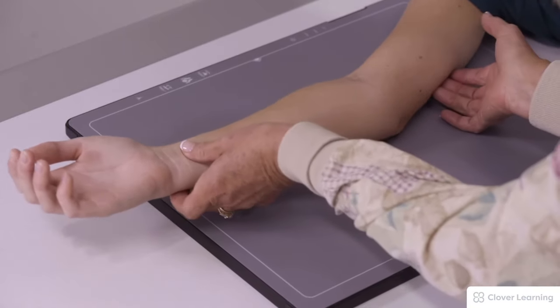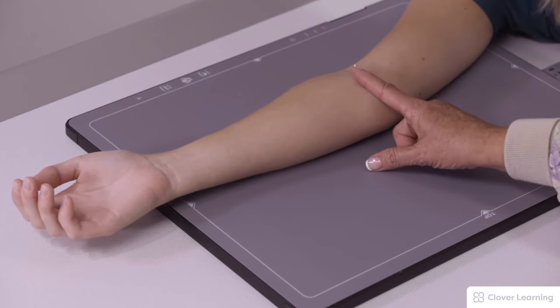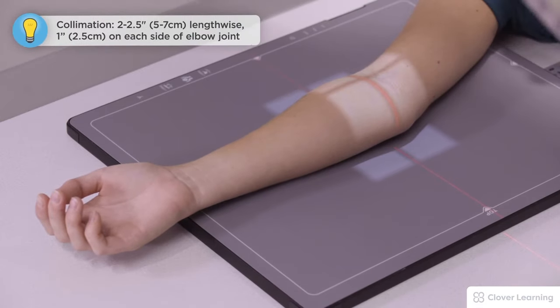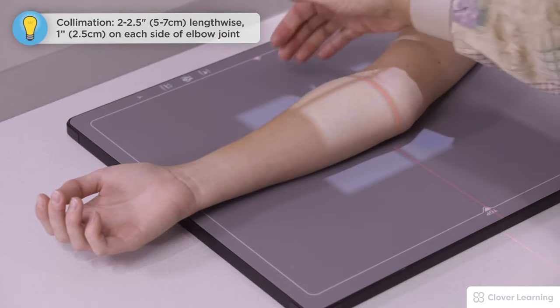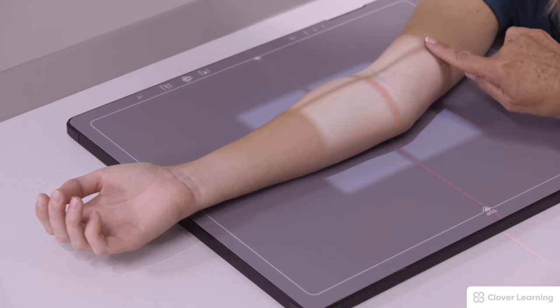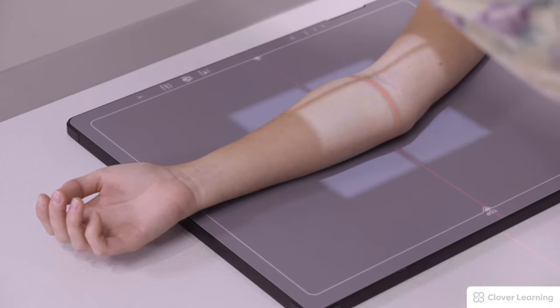We're going to pick the long axis of her arm down the long axis of the IR, the central ray right at the elbow joint. We want to extend our collimation to about an inch on either side. We want about 2 to 2.5 inches into the humerus and down into the radius and the ulna.